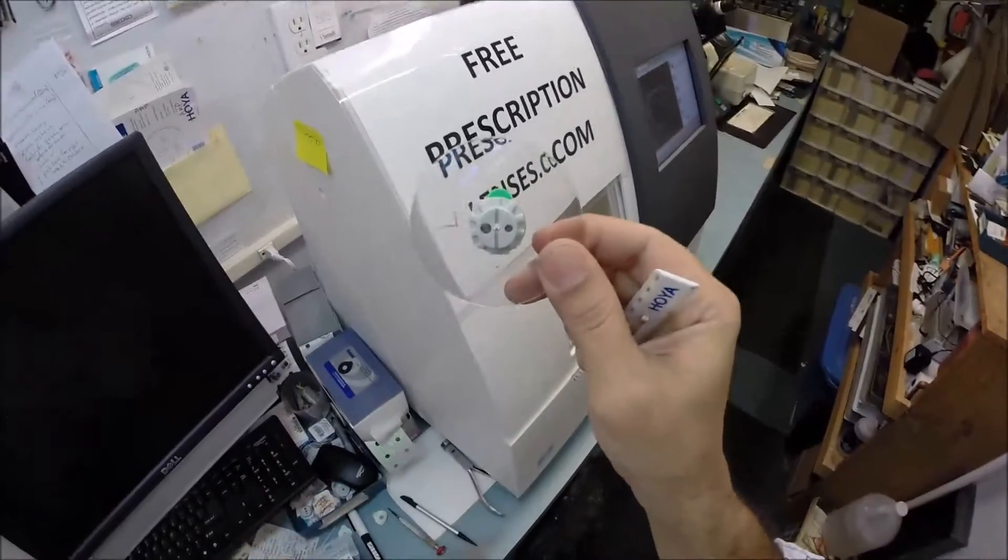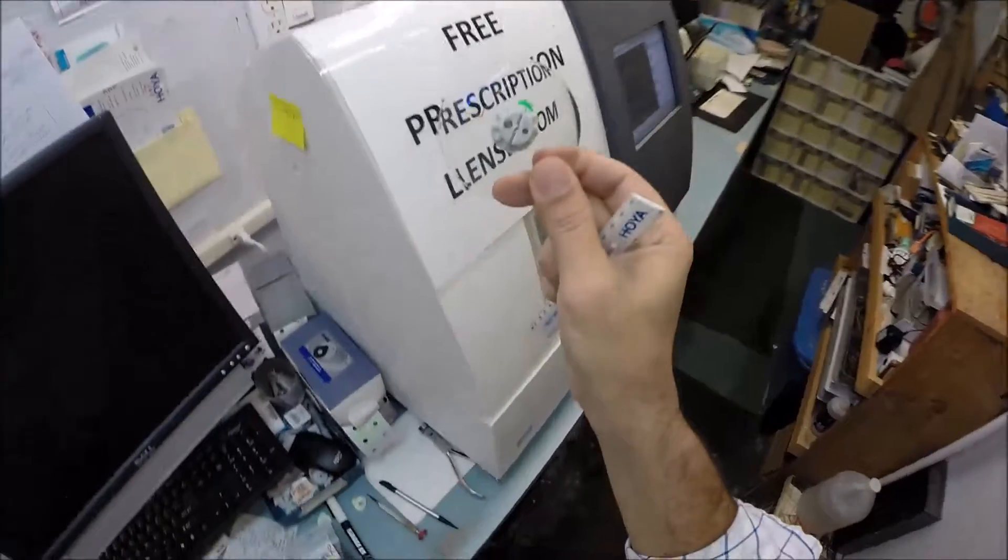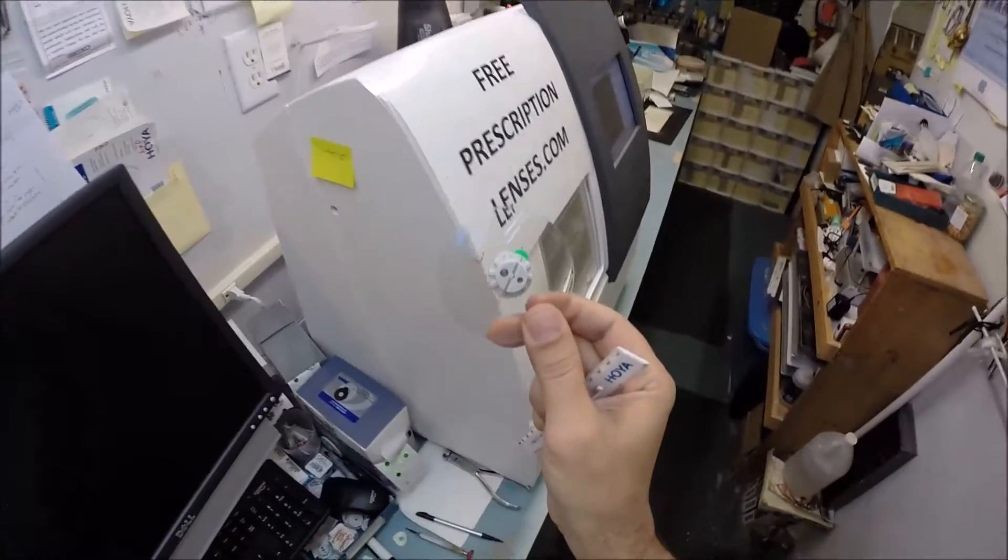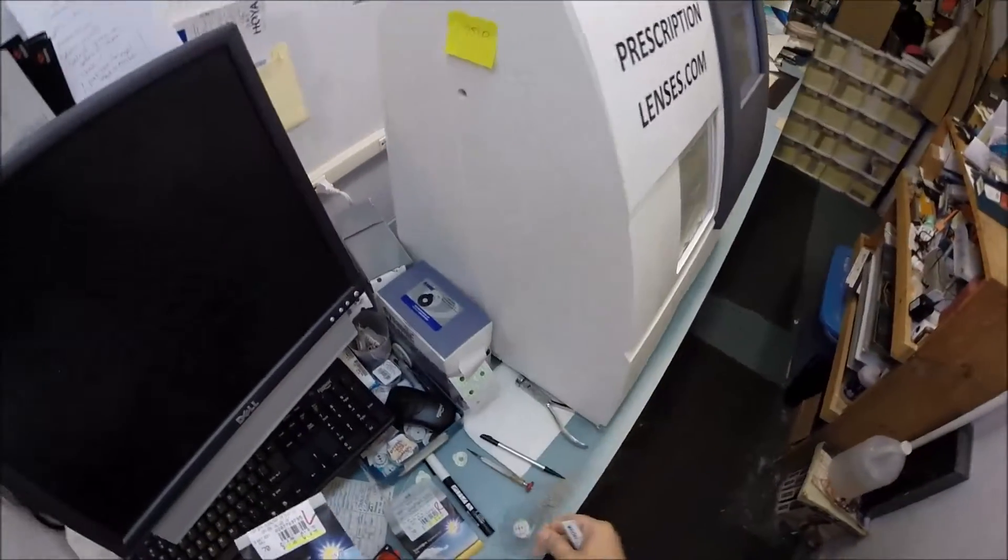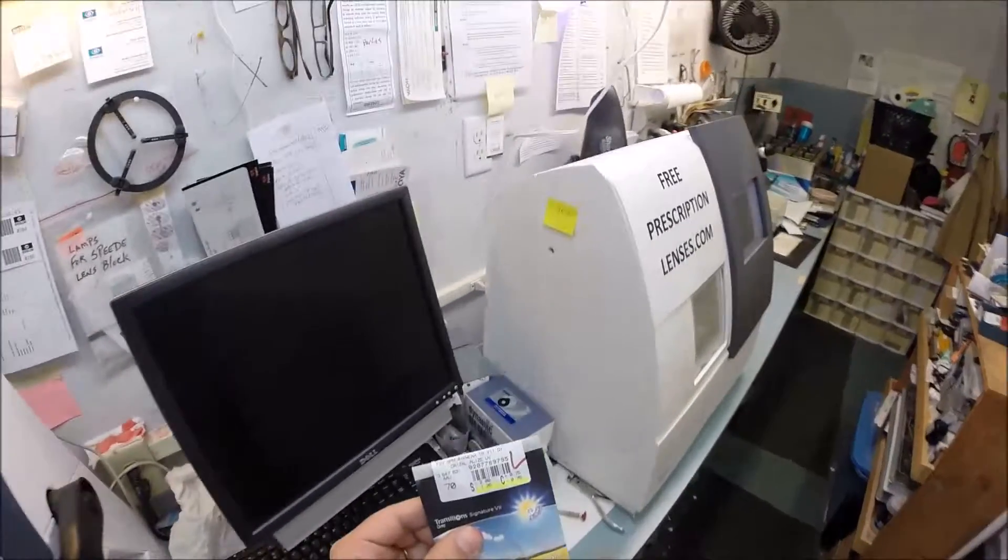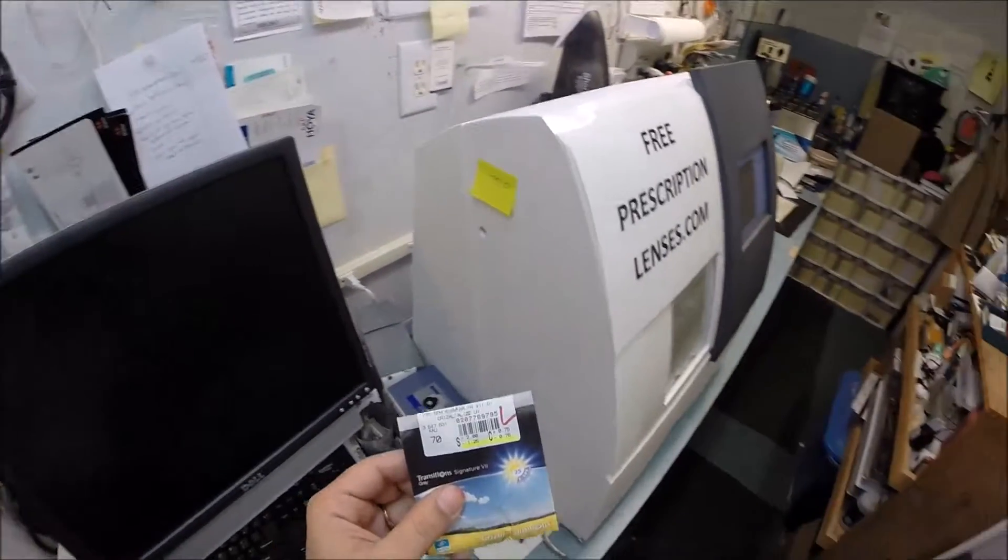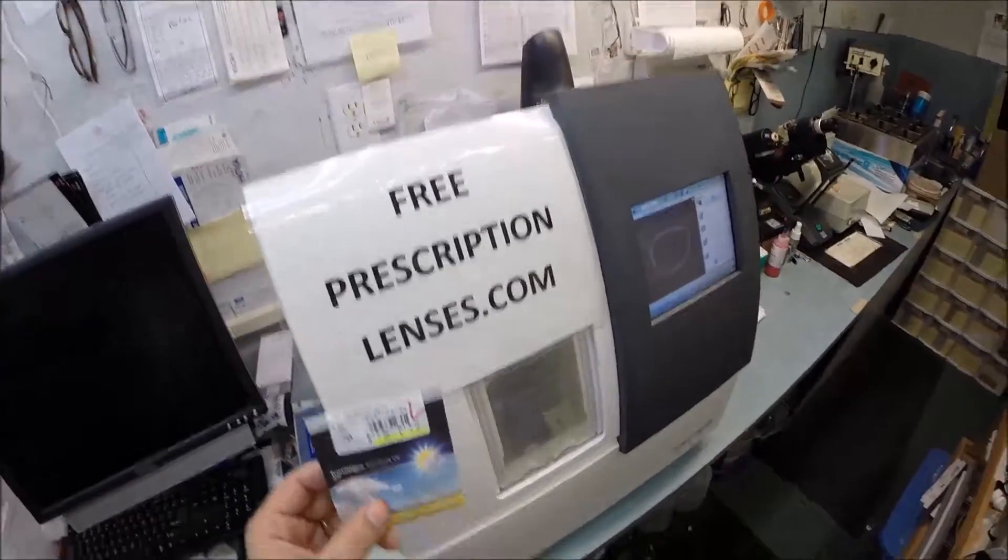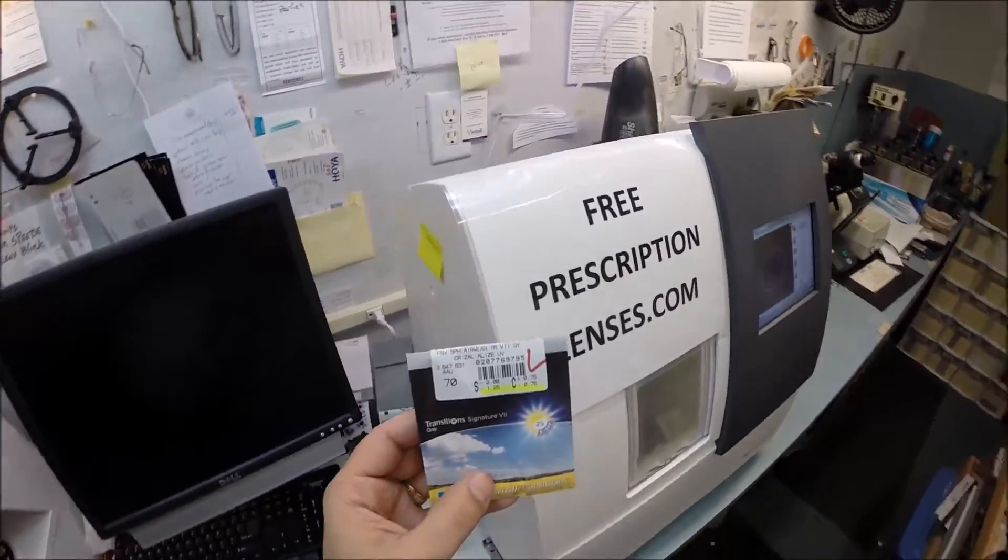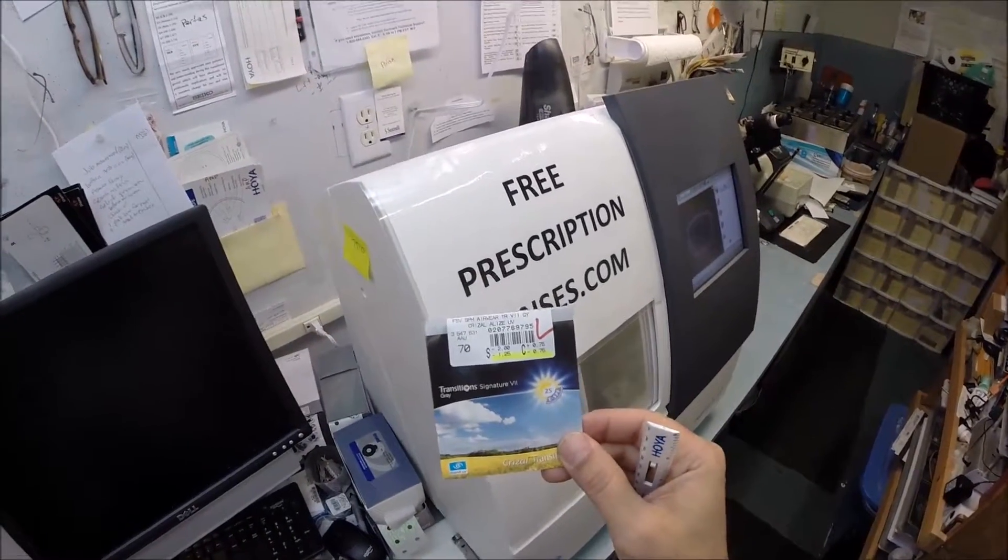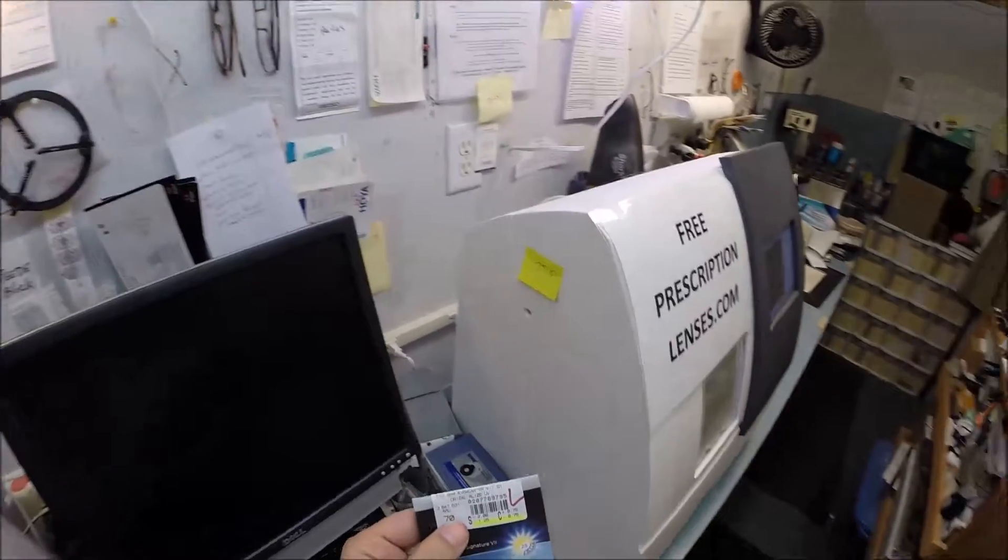Your lenses are made out of polycarbonate. This brand calls it air wear. Polycarb is 40% thinner and lighter than regular plastic. It is also virtually unbreakable. Your lenses are bulletproof up to 22 caliber and have both UVA and UVB protection.